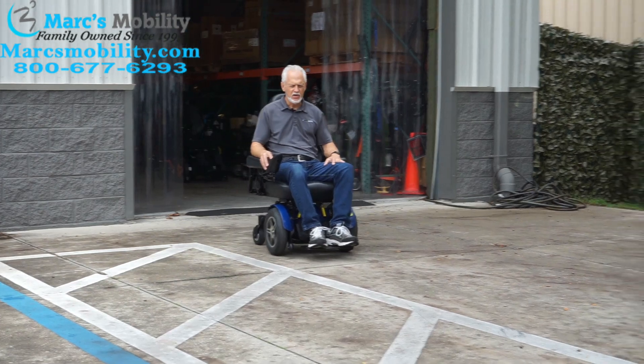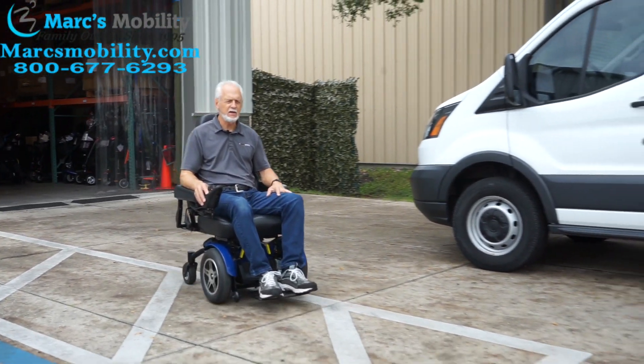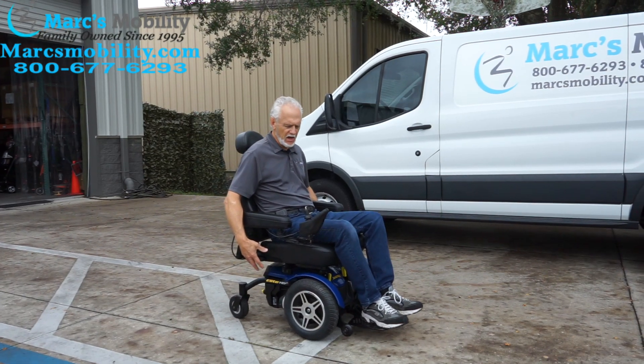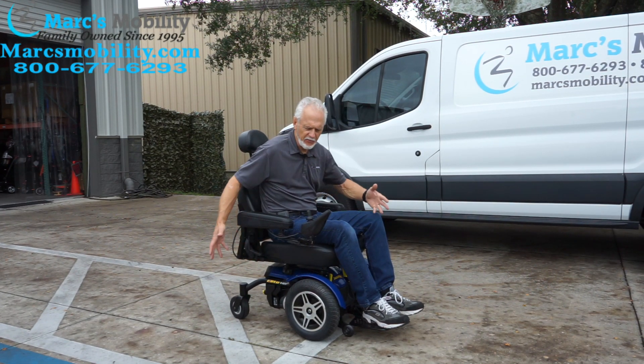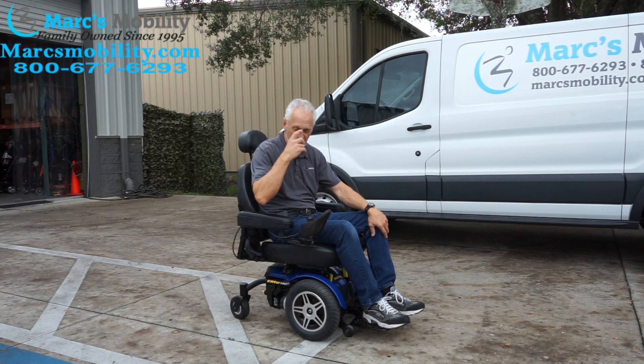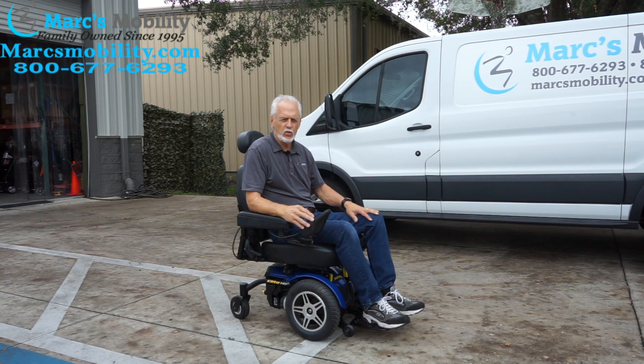When you stop with this power chair, the brakes come on automatically — it has a built-in brake so within a couple of feet it will stop. Even though you're in gear in the middle of a hill or going up a hill, it will not roll out on you.